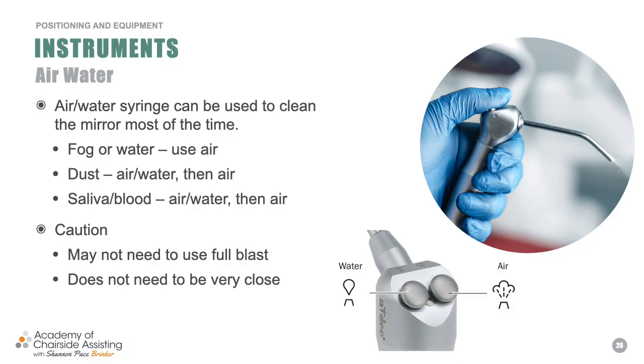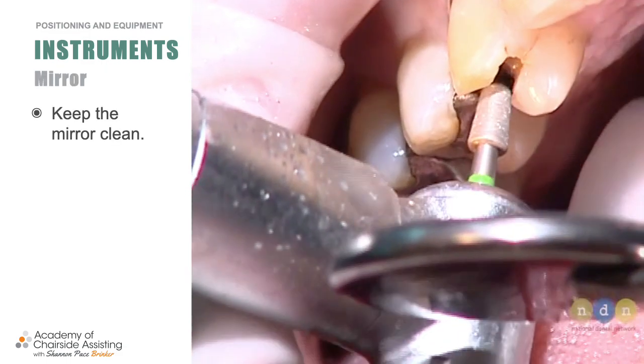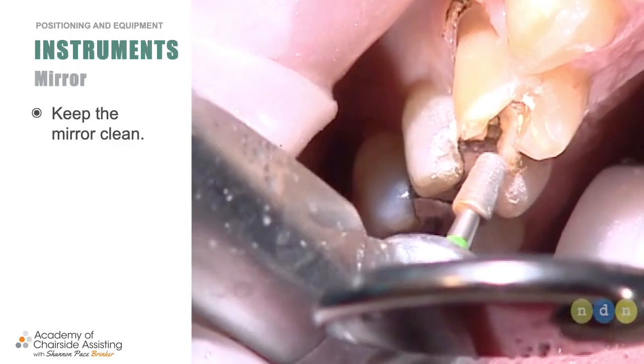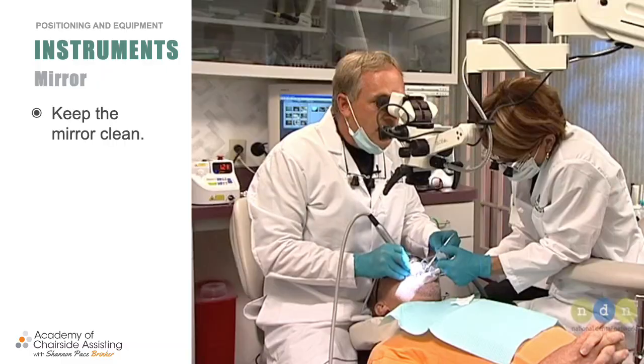And one of the things we want to do is we still want that direct syringe tip towards the tooth, but making sure that anytime the dentist is working, we're continuously keeping things clean and paying attention to the back of the mouth, and anytime the dentist is pausing, we're going to rinse and dry the site, okay? Just like here, let's demonstrate. When the doctor has got the mirror in, I'm rinsing the mirror off, I'm rinsing the site, I'm keeping things nice and dry, because if he can't see, and I can't see in the mirror, then I know he can't, right? So I want to make sure of that.